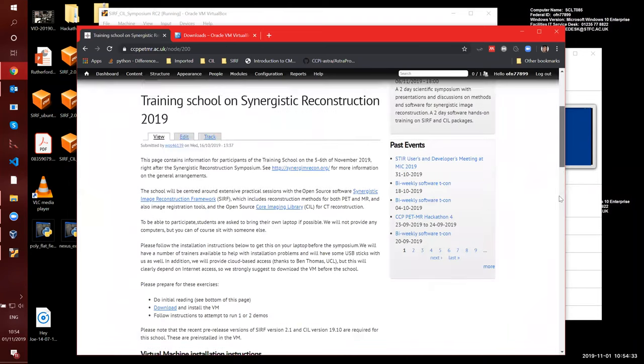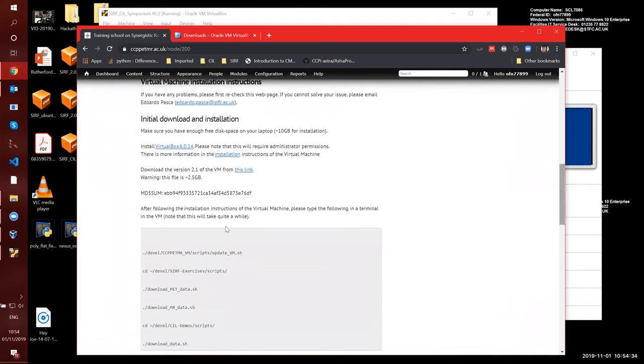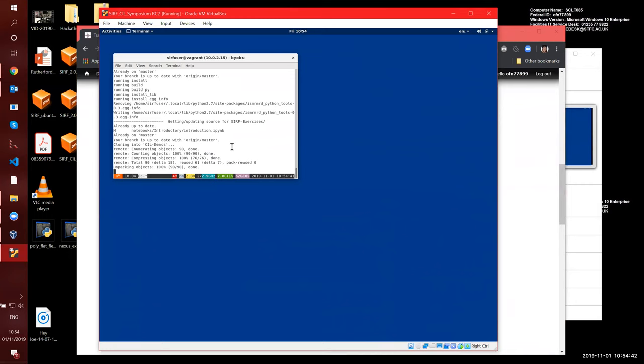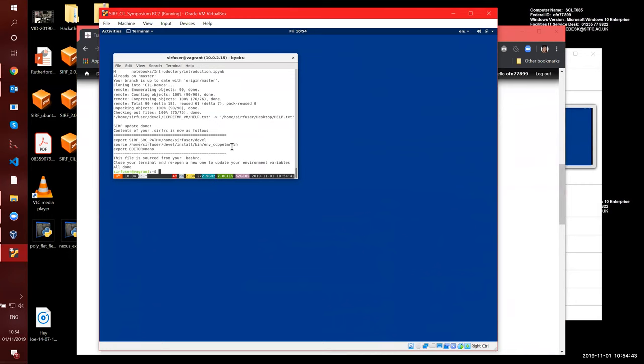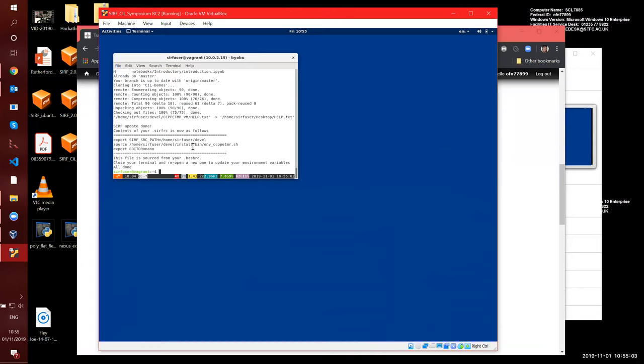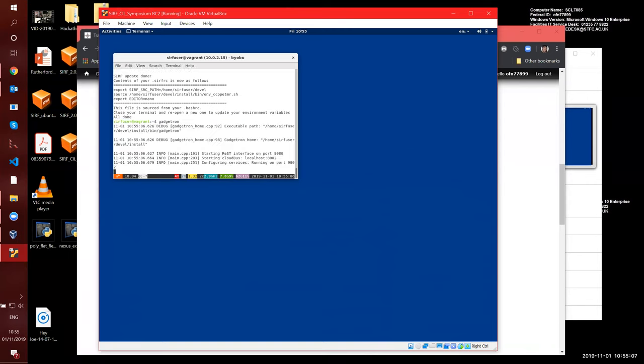So now you have to write command, and by the time we've finished here, I'm finishing to do all the updates, so now it's all done, so now we need to start Gadgetron, if we want, if we are interested in MR. And you can skip this if you're not, but I'll show you how you can start Gadgetron by typing Gadgetron. And this is now running.